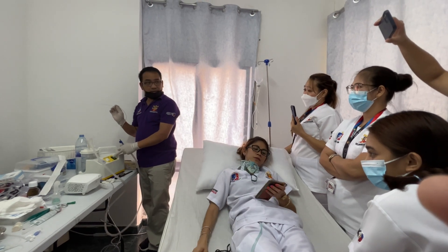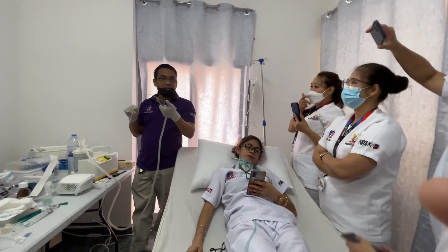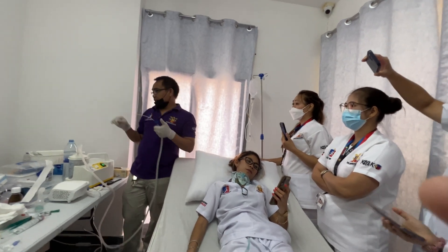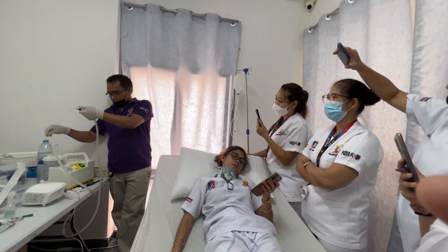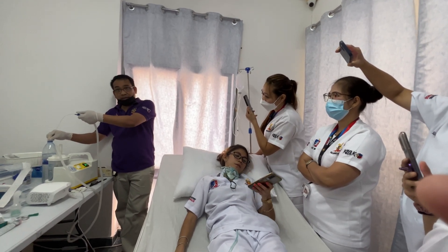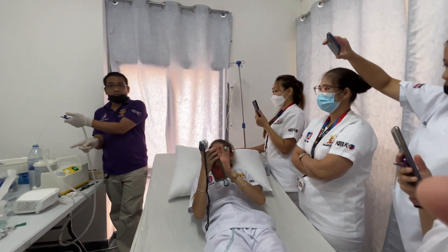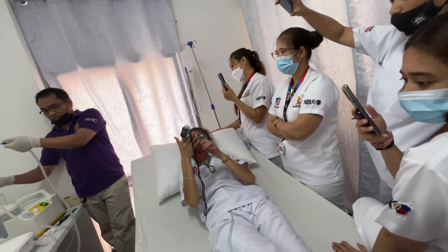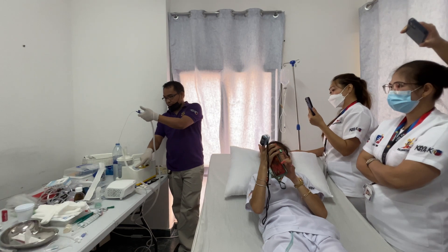I'm going to turn on my machine. This is the controller — not the pressure. I will submerge the catheter and then close the controller. If you open the controller, there is no suction pressure going in. If you close it, there is pressure and fluid enters the canister. You can see the pressure going up.